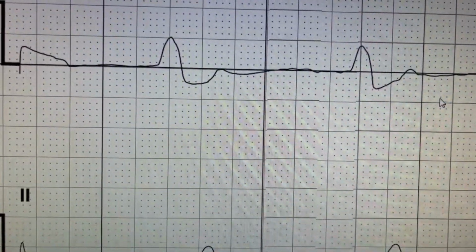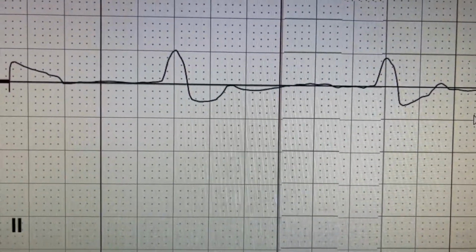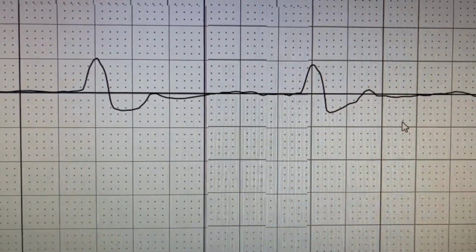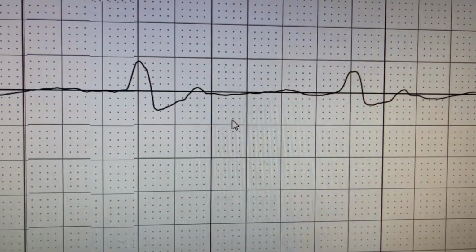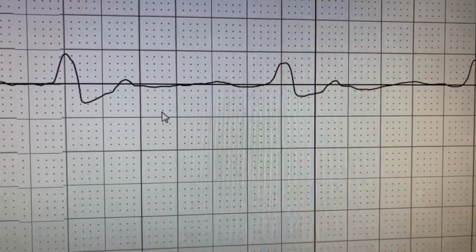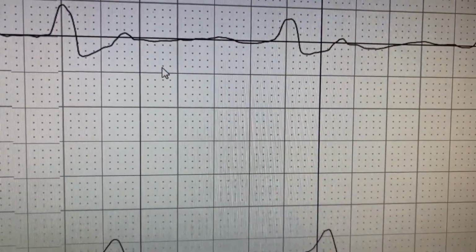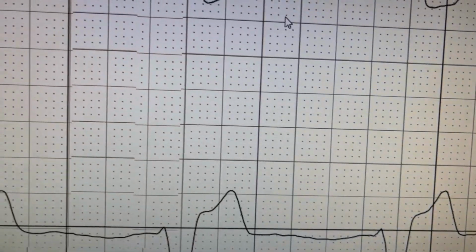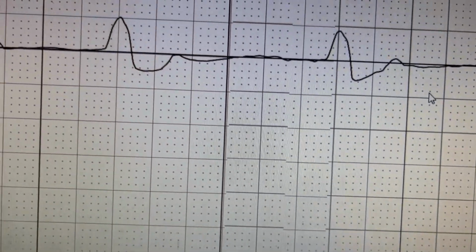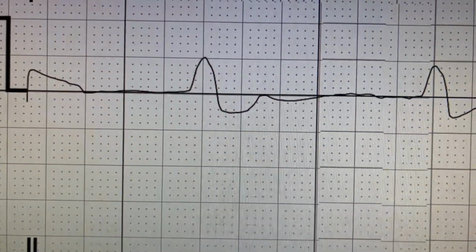Left ventricular hypertrophy, LVH. This indicates thickening of the heart muscle, often a compensatory response to decreased pump function. While not always associated with reduced ejection fraction, it warrants further investigation. Q waves. Pathological Q waves can signify prior myocardial infarction, which can lead to decreased ejection fraction.